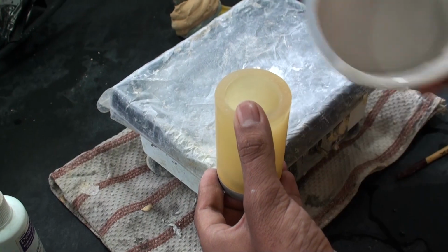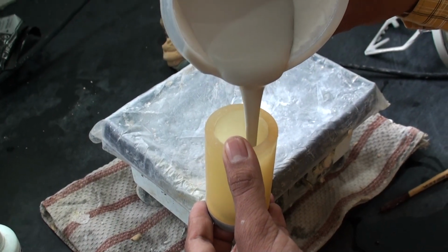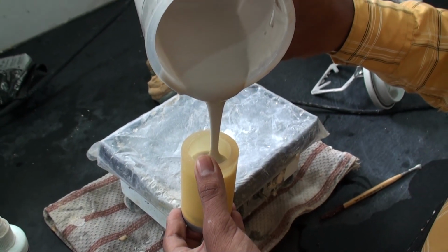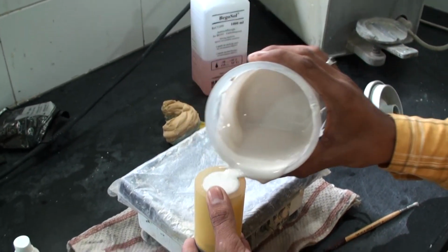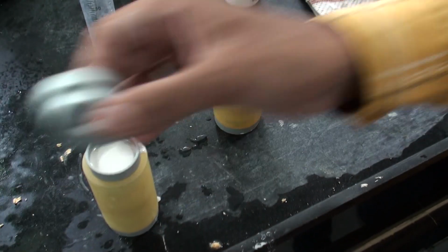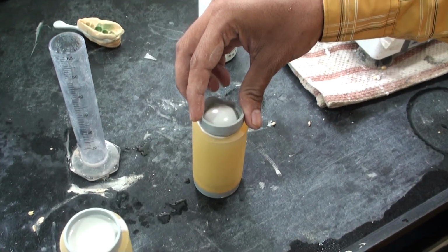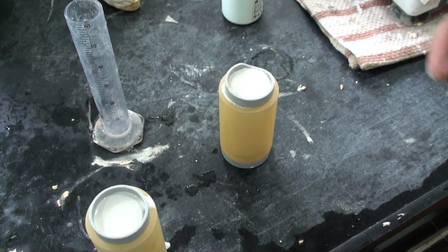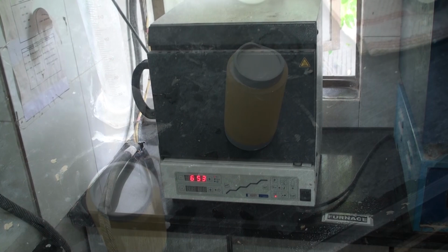There we go. Once that's done, then you put the rest of the material into the ring. This is obviously done in a way that avoids incorporating any air bubbles. Put the caps on it.